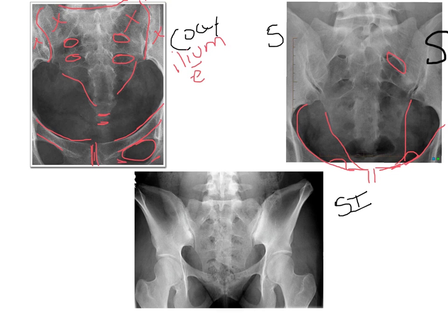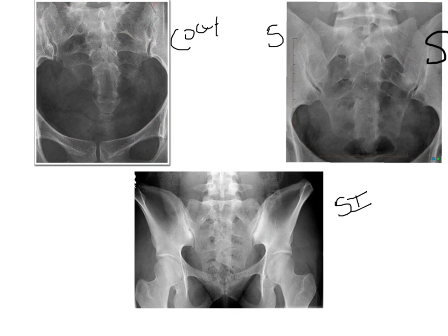Do they appear open? And are they free of superimposition from the pubis symphysis? In this case, they are, but we've clipped some important anatomy, so we would need to redo this image. Plus, we're missing a marker. Don't know if we're looking at right or left here. Okay. Moving on to our SI joints.